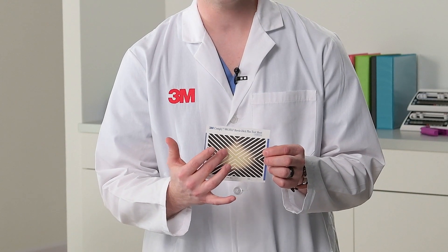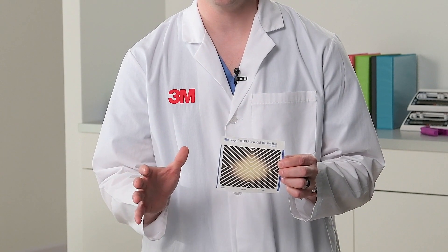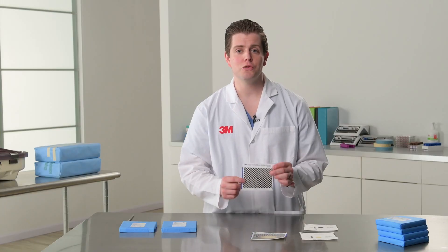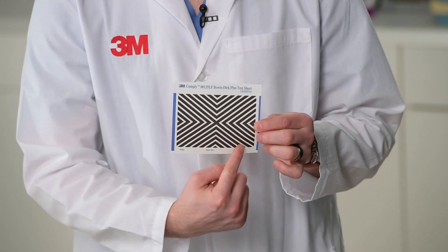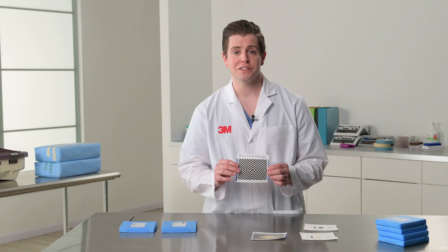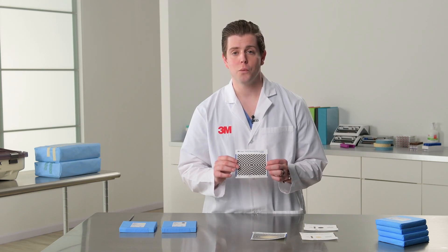Typically, with failures, you'll notice a color change in the center, which works its way out to the edges of the test sheet. If the test sheet shows a uniform color change, moving from complete black to a dark brown color, this would indicate that the sterilizer has passed, and you can now use that sterilizer the rest of the day.